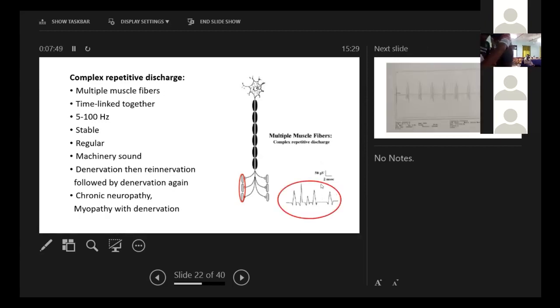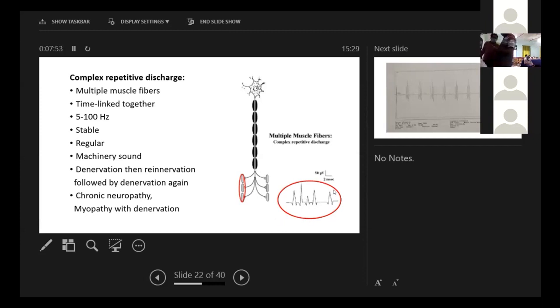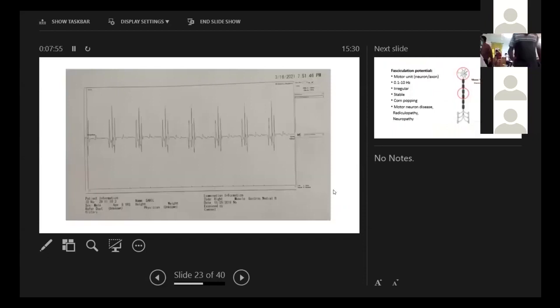How does it look like? It is this kind of thing. There is timing. There are multiple muscle fibers involved. So on a tracing, it will look like this.